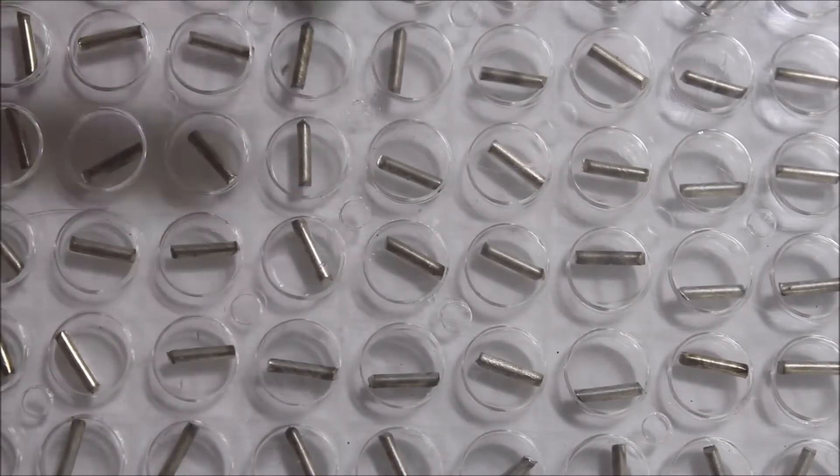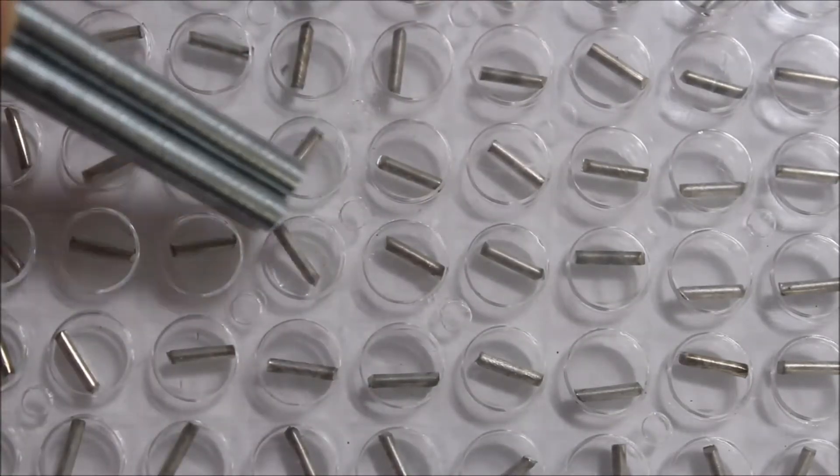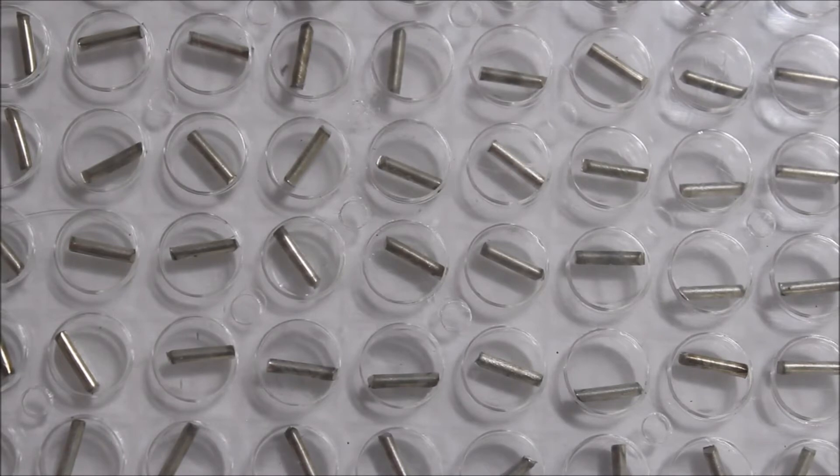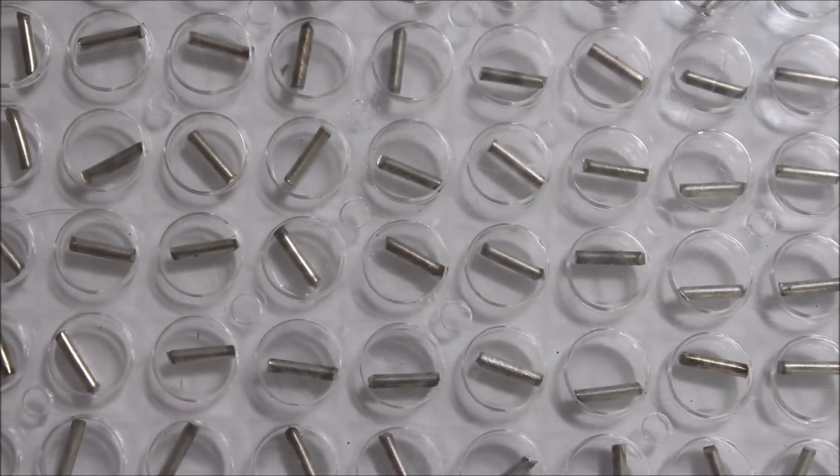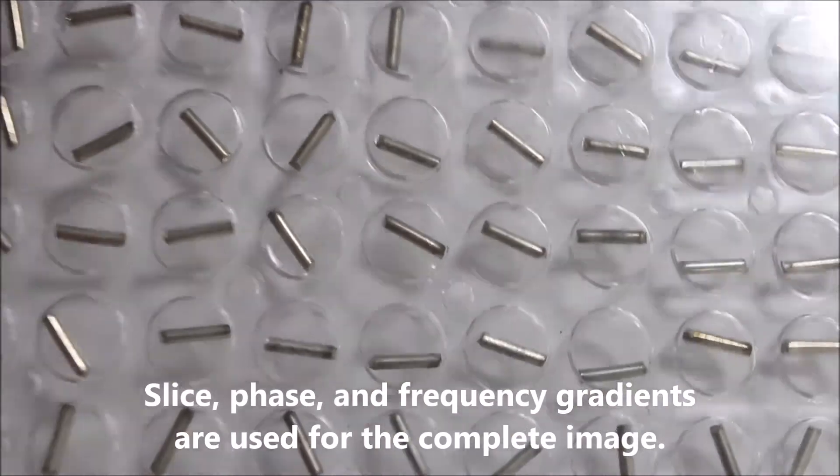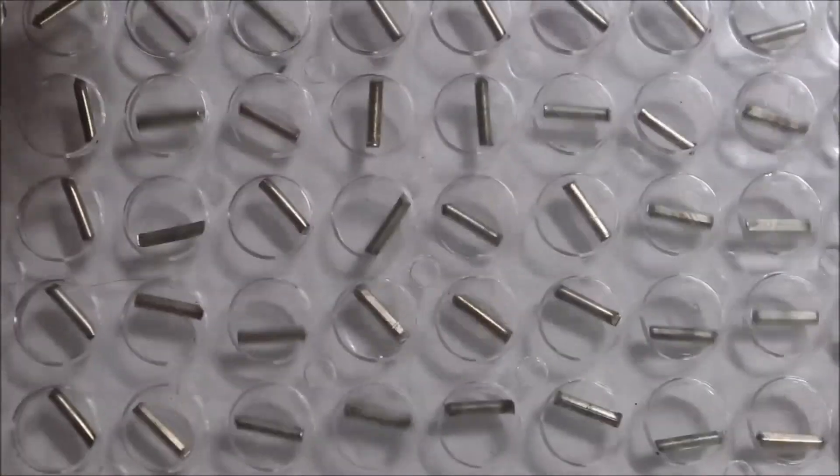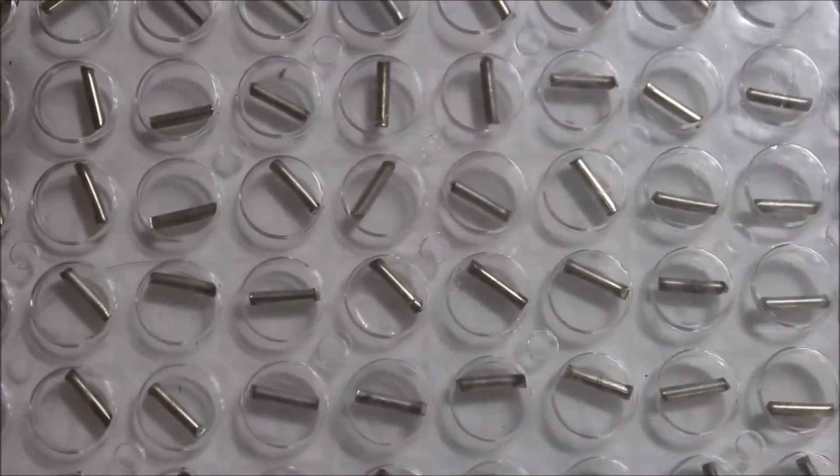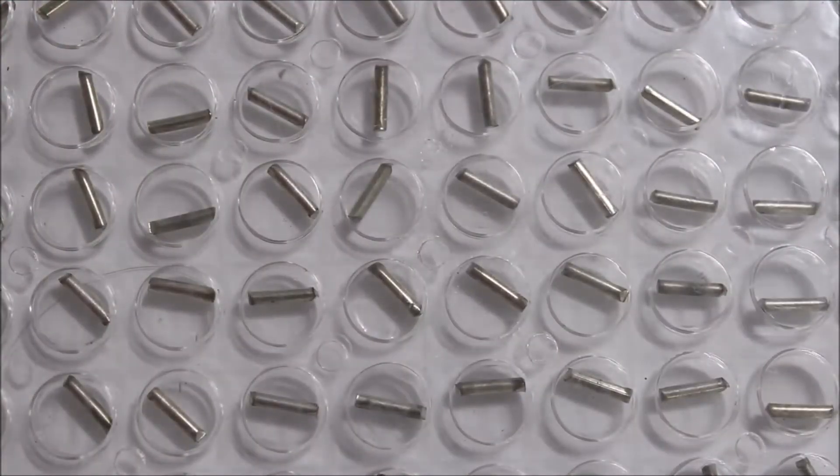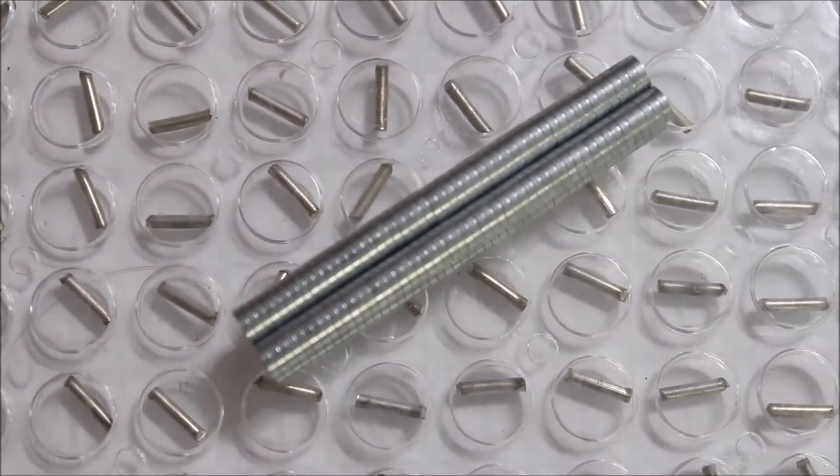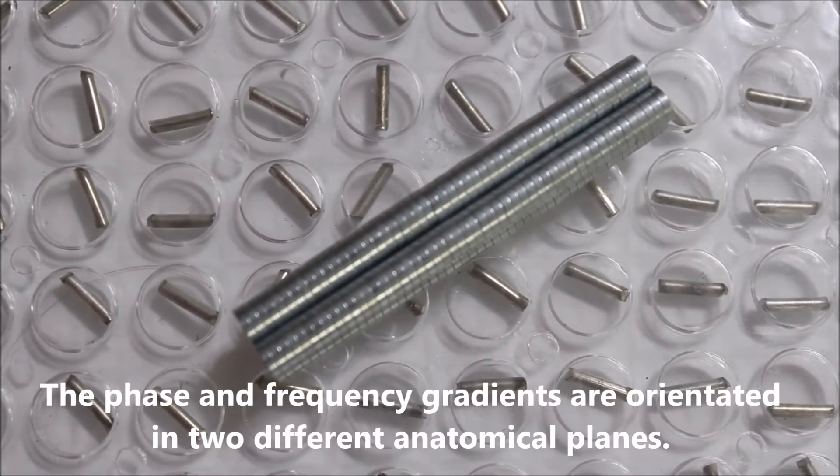We only did that, we get one data point for the whole image. We can't separate everything out. We need to add gradients. So we have a slice select gradient, so that is mimicking that we are taking images from this one discrete slice. So we turn on a slice gradient and that energizes this one slice of tissue.